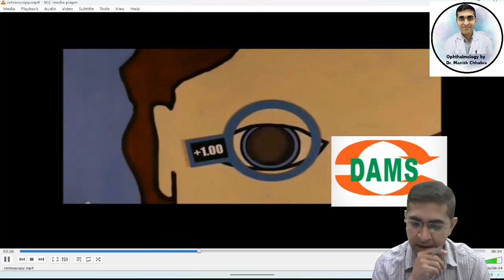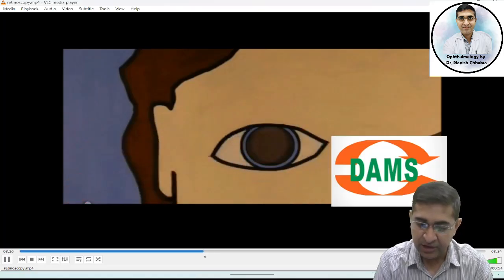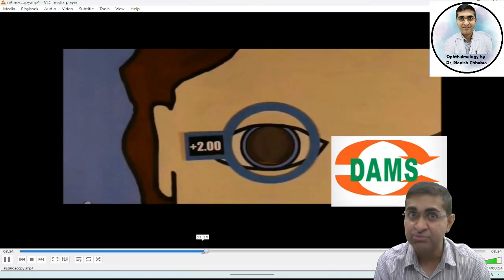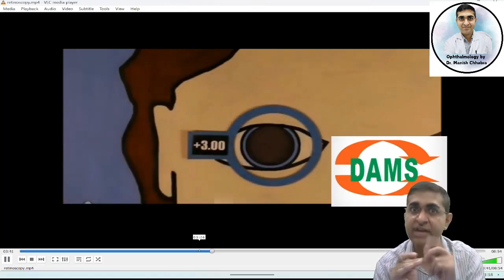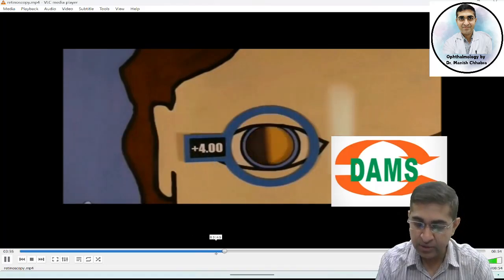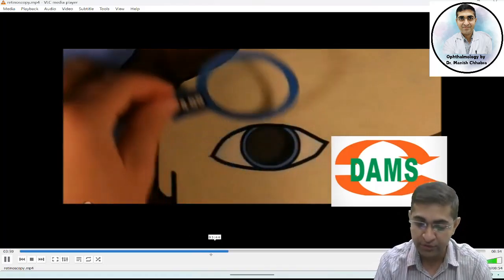Now again you will place plus glasses, and you will increase the power again. Okay, still it is moving along the movement of the streak of light, both at the x-axis and y-axis. First we'll conceptualize this, then we are going to solve the numericals. Yes, okay, again you can see that the reflex is getting very bright.